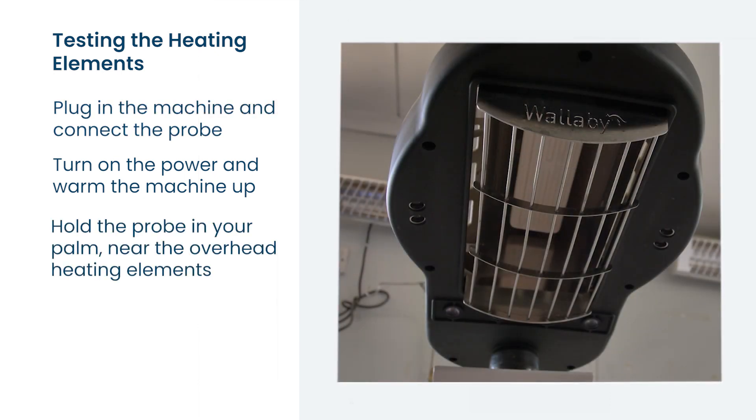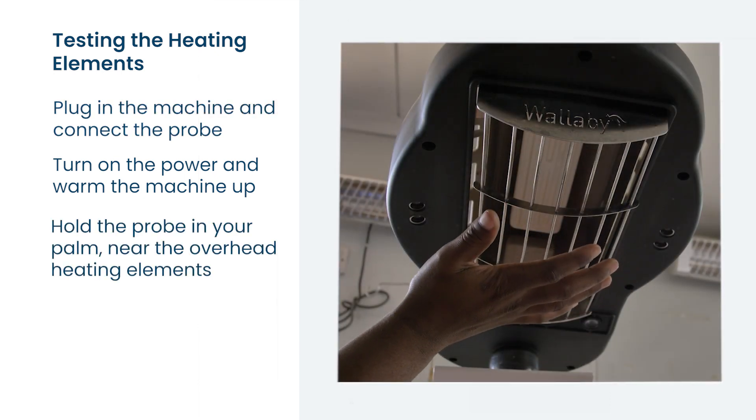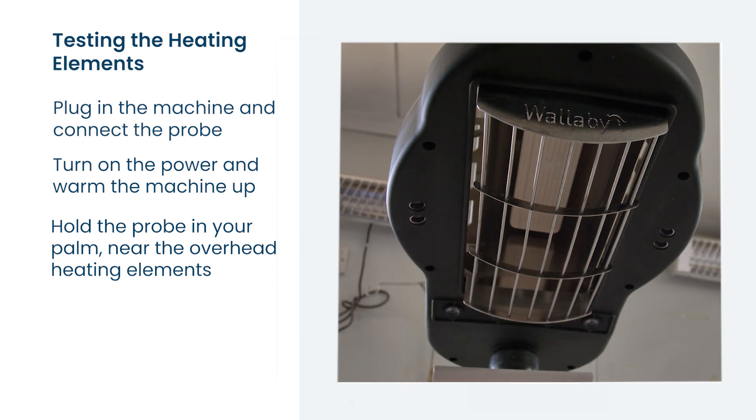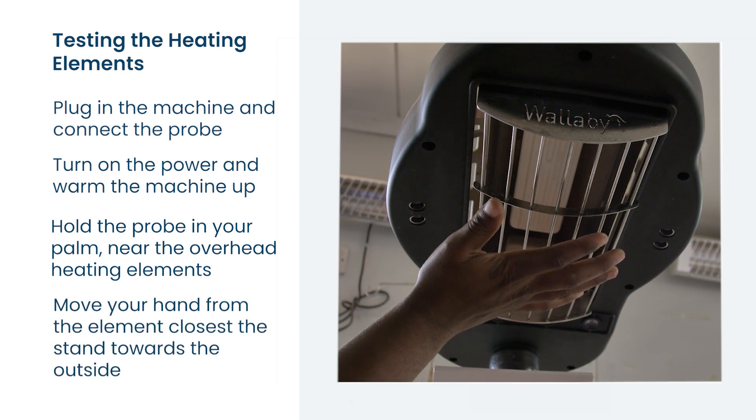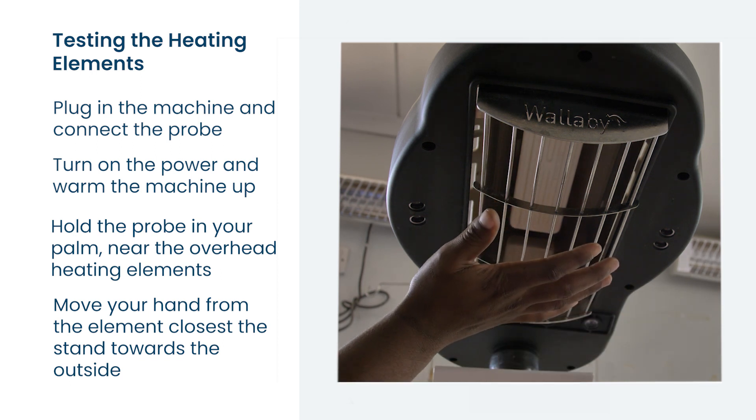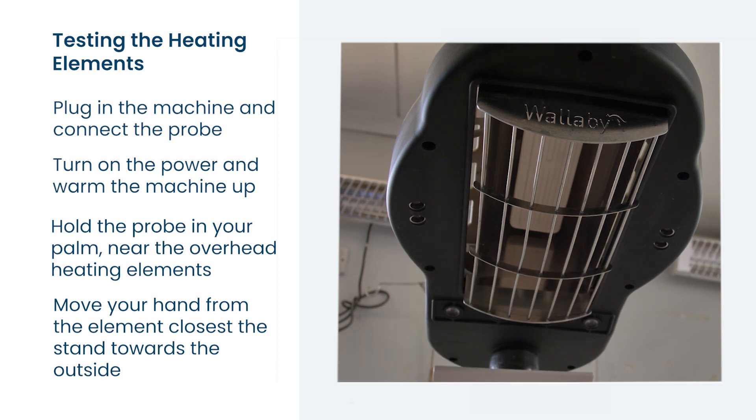Then hold the temperature probe in the palm of your hand and hold your hand up near the overhead heating elements. As you move your hand from the element closest to the stand towards the outside of the machine, if the heat suddenly drops it might be that some parts of the heating elements are not working and need replacing.